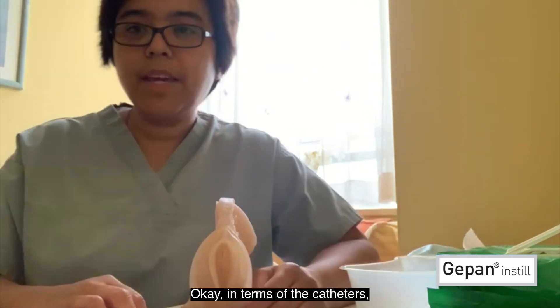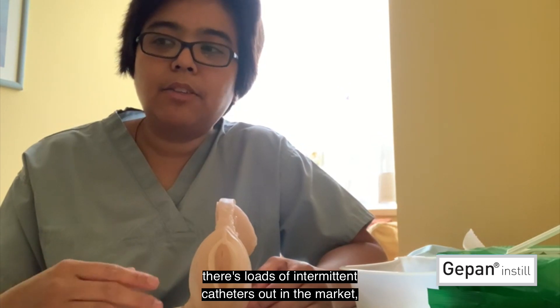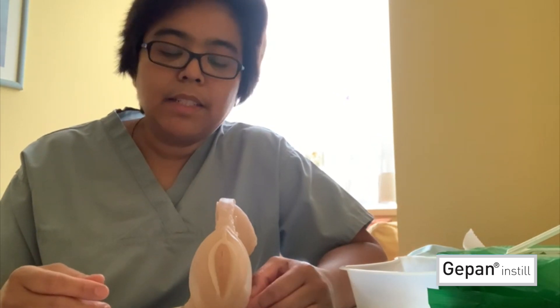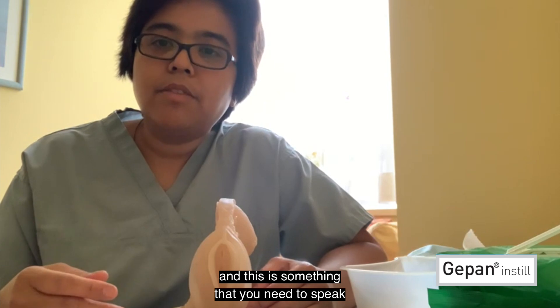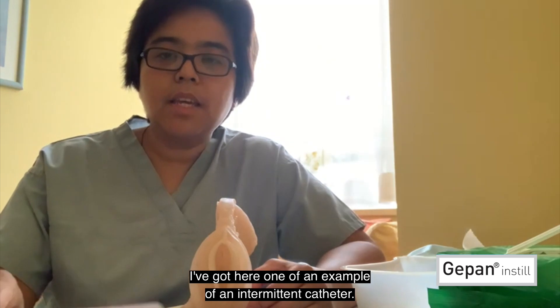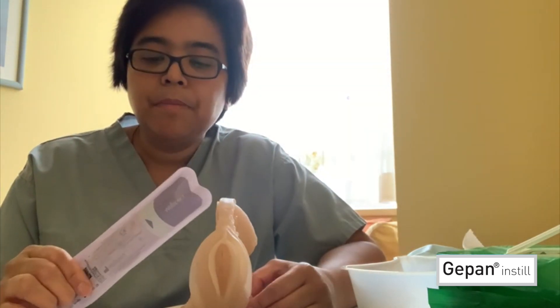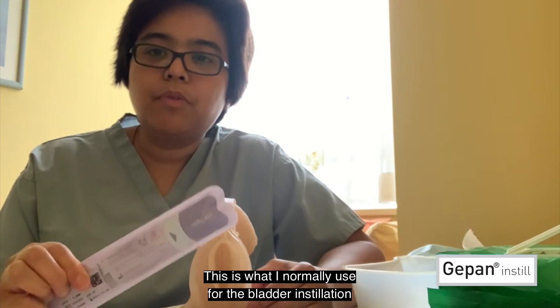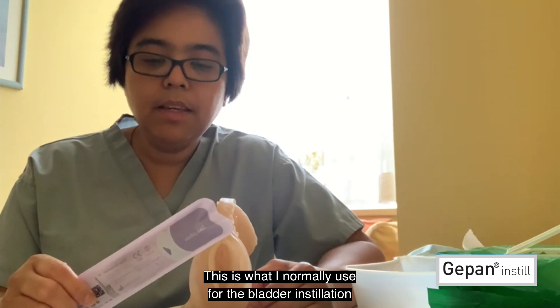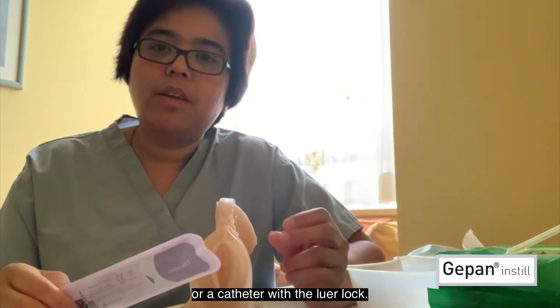In terms of the catheters, there are loads of intermittent catheters out in the market, and this is something that you need to speak to your healthcare professional about. I've got here an example of an intermittent catheter. This is what I normally use for bladder installation — a catheter with a luer lock.